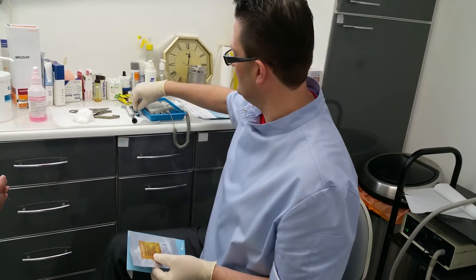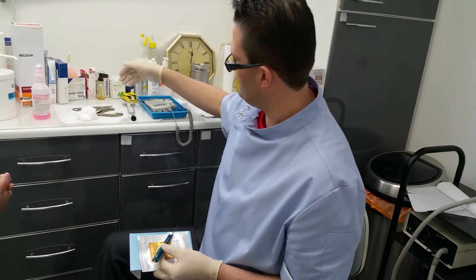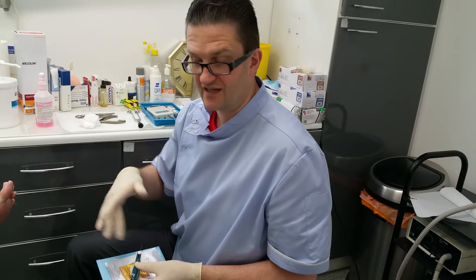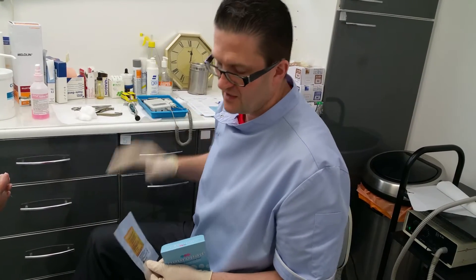Earlier on we tested for a monofilament test, we tested with a neurotip with a little sharp pointed bit, we tested with vibration and also temperature. All of those nerve endings get affected by diabetes, but the ones we're testing now get affected first of all. So we could have all positive responses to those other tests and actually this test could show up that there are some early changes.